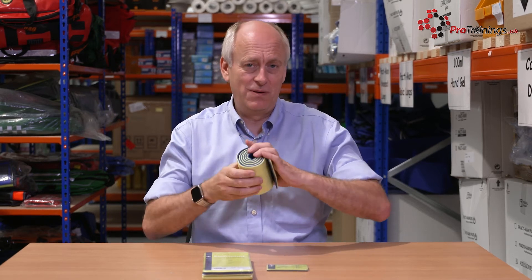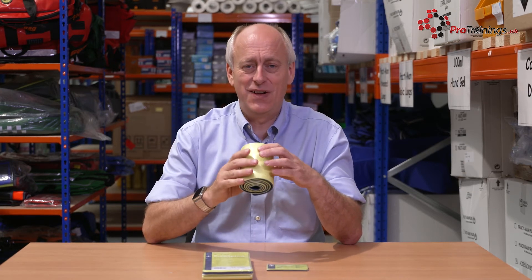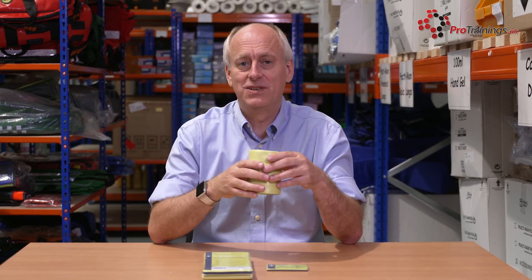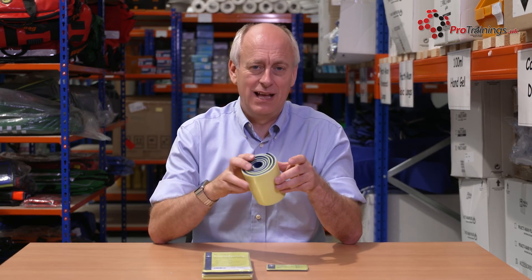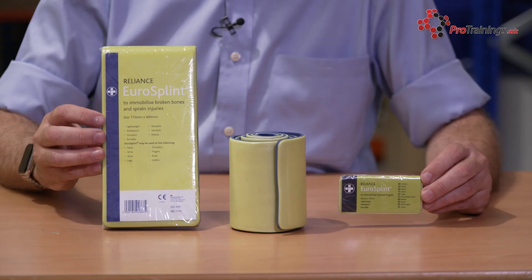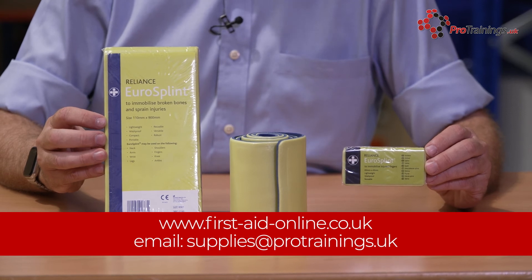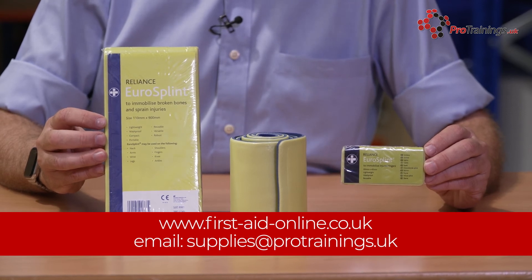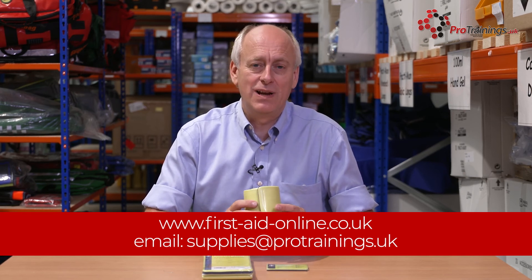These within the training world can last for years, but ultimately they are designed to be used once in an emergency situation. When you're using them week on week out in the training world, you eventually will damage and break them, but we've had these last for many years before they need to be replaced. The range of three sizes is available directly on our website firstaidonline.co.uk, or you can contact us by emailing supplies at protrainings.uk.